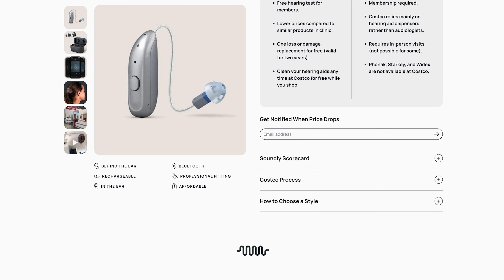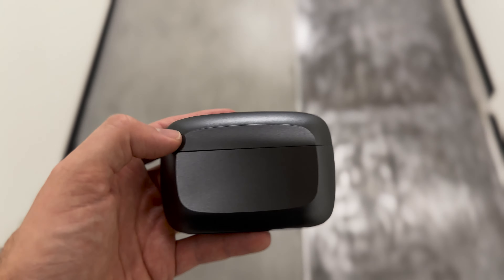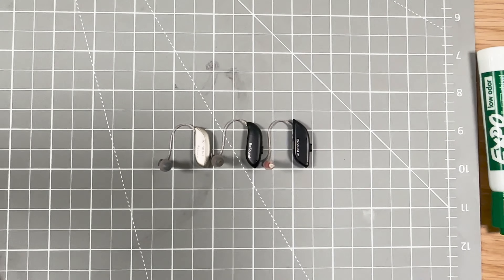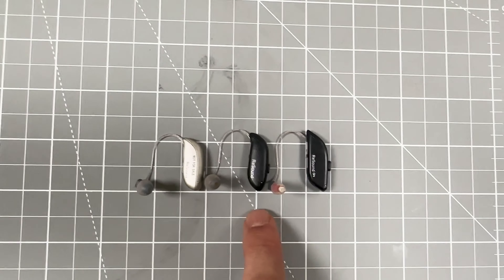Let's take a closer look at the Jabra Enhance Pro product. We're going to walk through our Soundly scorecard, which takes us through some of the key features that you'd find in any hearing aid and compares them universally across the hearing aids that we've reviewed. Starting with design: the Jabra Enhance Pro is fairly standard in the market — a receiver-in-canal hearing aid that sits behind the ear, with a wire that goes up over the top of the ear and a speaker that plays sound into your ear canal. One thing that's really cool is that they've cut down on size over the last few generations, and now Jabra's hearing aids are among, if not the smallest, receiver-in-canal hearing aids on the market.